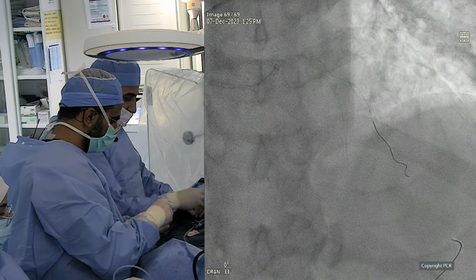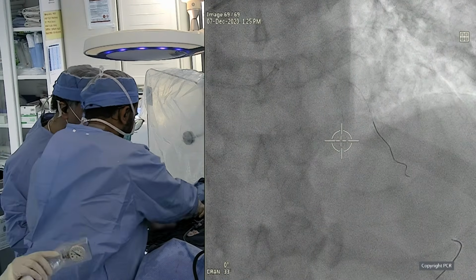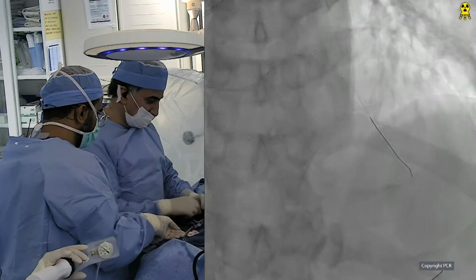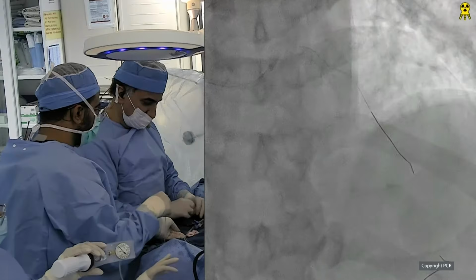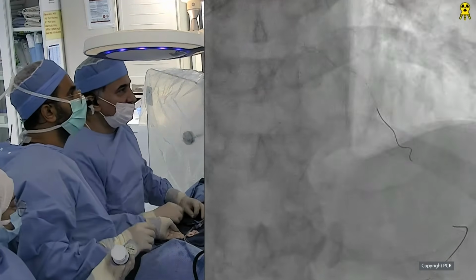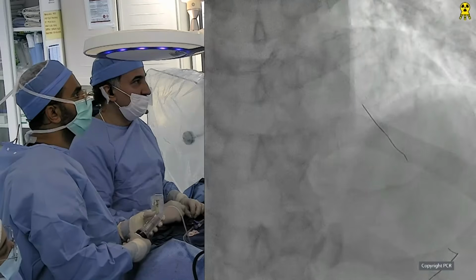We took a Zen stent 3.5 by 23 because I believe the proximal LAD should not be smaller than 3.5, and by the OCT it was 3.38. And you implant that with an overlap just distal to the ostium of the diagonal, correct? Exactly, with just a minimal overlap. We'll post-dilate and then we'll assess the diagonal again.